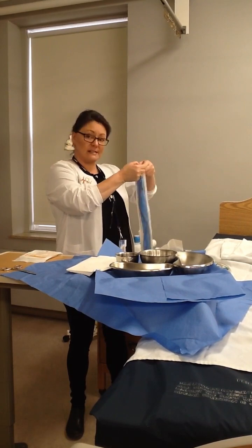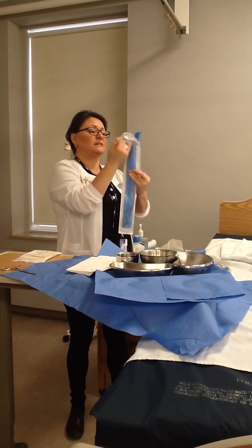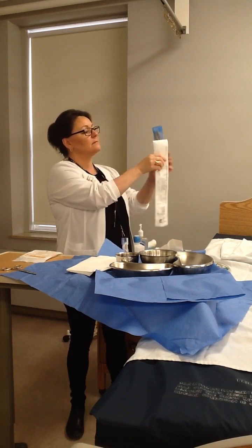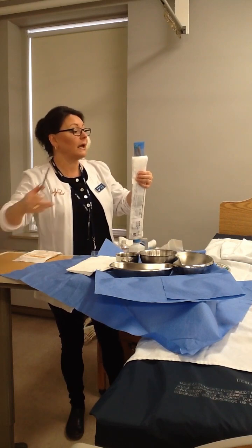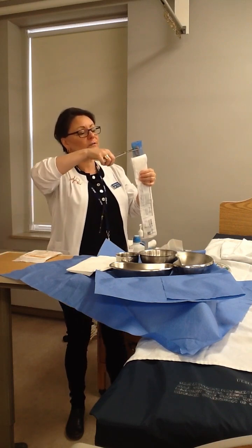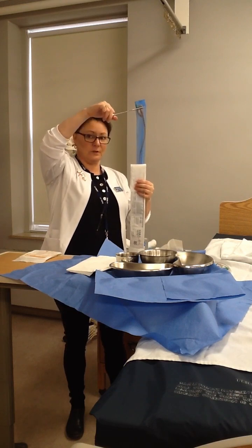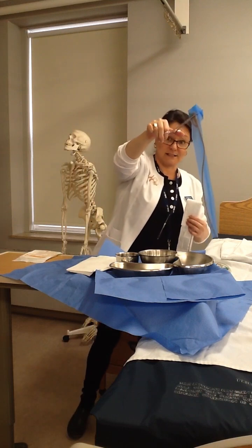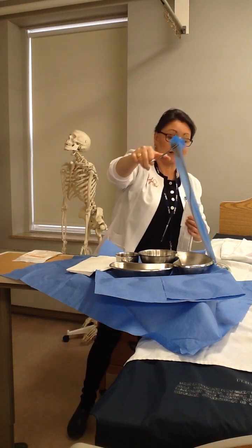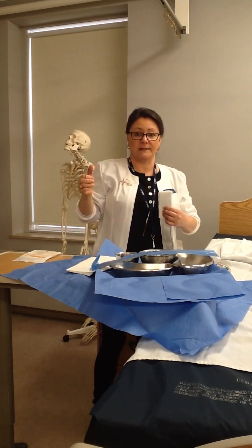I want you to use the same technique. Peel it down so you can see those two lumens right there. Take your tool and reach and get a good hold of them. Squeeze and pull up nice and high. Don't let it fall below the table. Then come towards your tray, and because this is all sterile, lay that down horizontally across your tray, just like that.